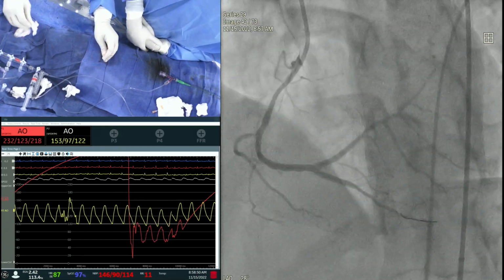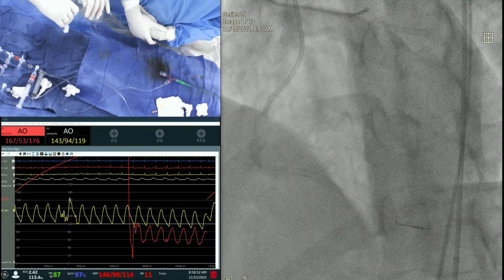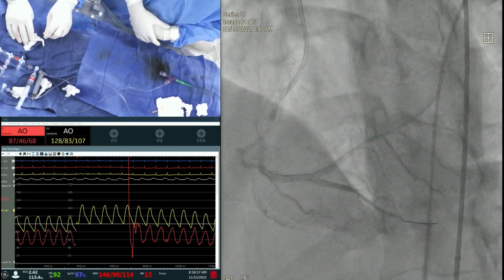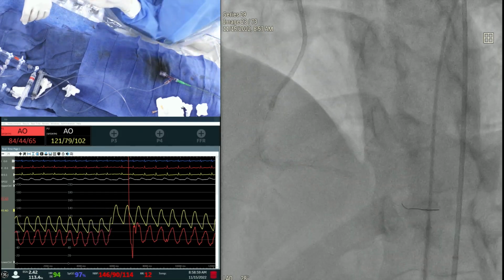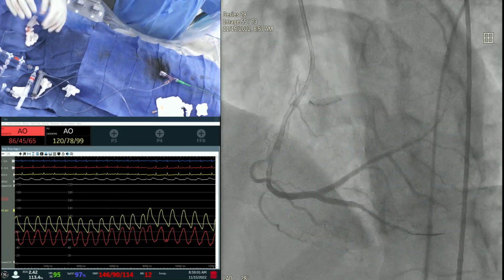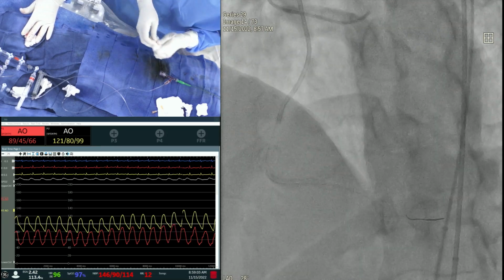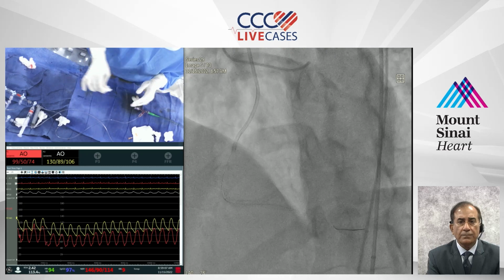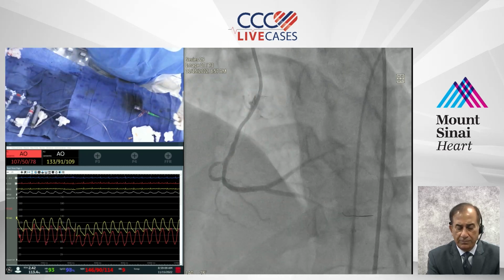So we'll recross and KISS. The proximal lesion is looking better and better. There was mild disease, I think we'll leave that alone. So we'll recross and KISS. Where is the Fielder wire? Yeah, looking very good. We needed this mini crush, excellent, otherwise we would not be in that good result.